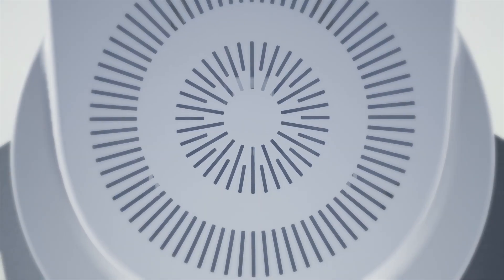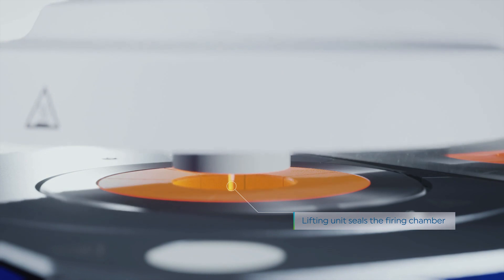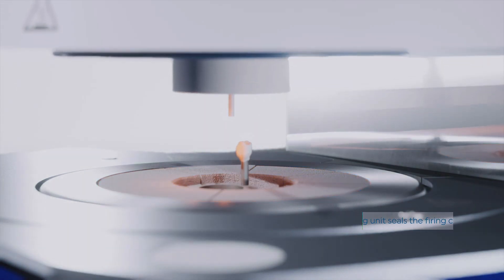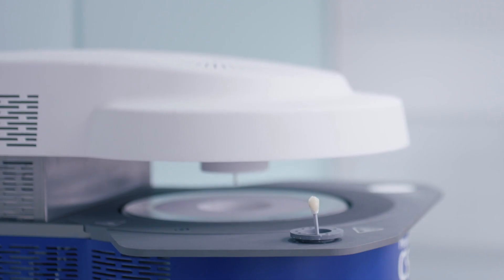The same opening mechanism that helps dry your restoration also helps to cool it upon completion. At the end of the program, the restoration is lifted out of the firing chamber and the lifting unit seals the firing chamber. In this way, the restoration cools down faster without being exposed to the residual heat from the firing chamber.